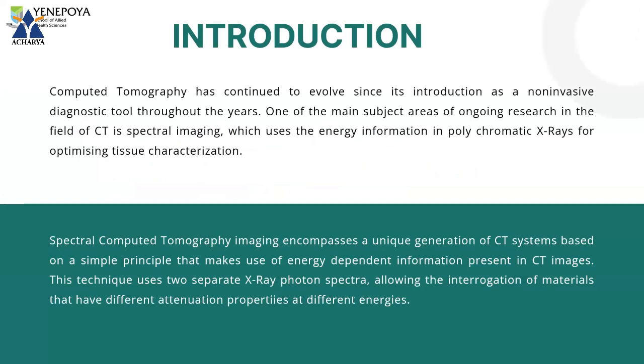Computed tomography has continued to evolve since its introduction, throughout the years. Researchers and scientists try to keep the radiation dose as low as possible and increase the image quality as much as possible, with the main goal of reducing the patient dose and providing very good patient care.